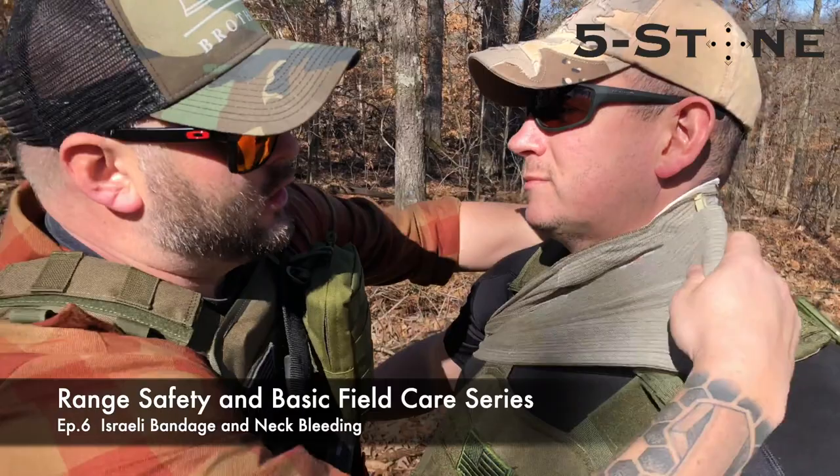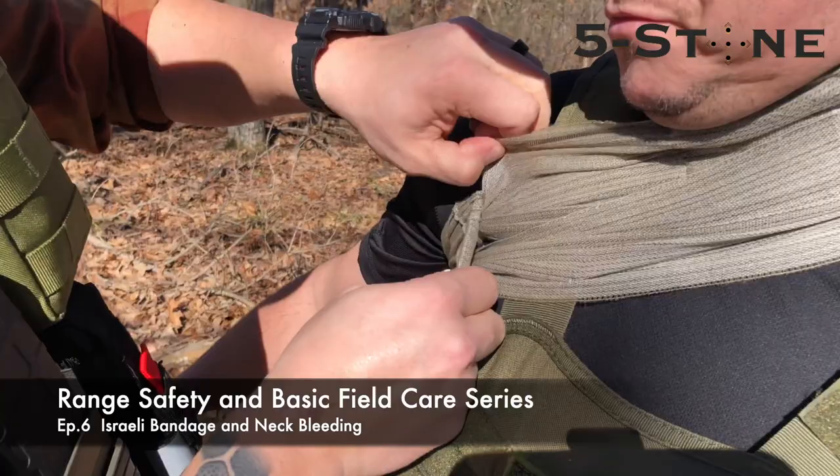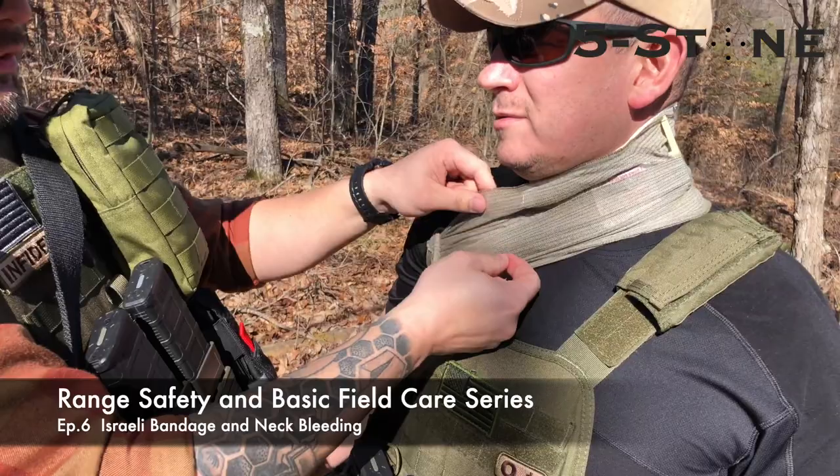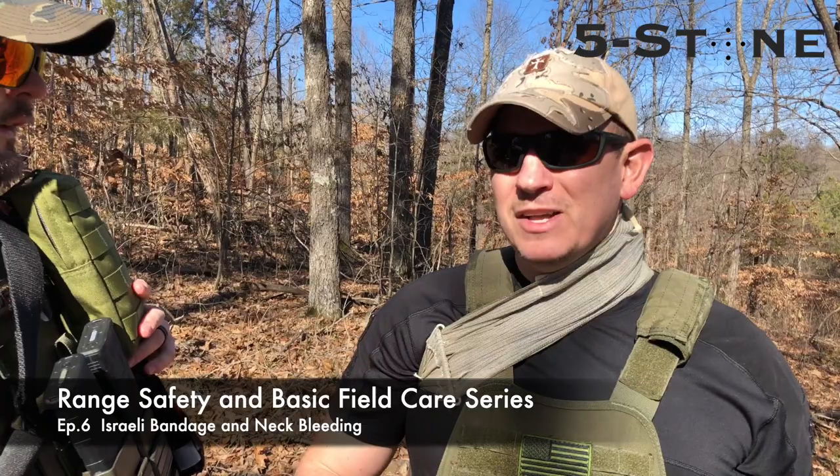From this point, you just wrap it over and over. It's easy after this. When you get to the end, it comes with alligator clips right here. You want to take it and hook it in what you've got there, and it grabs into that pretty much like an ace bandage. That is definitely secure. You've got to imagine — you're bleeding out and you can't put anything around your neck circumferentially, you're going to kill the person or kill yourself. You can't do that. But this is your option.